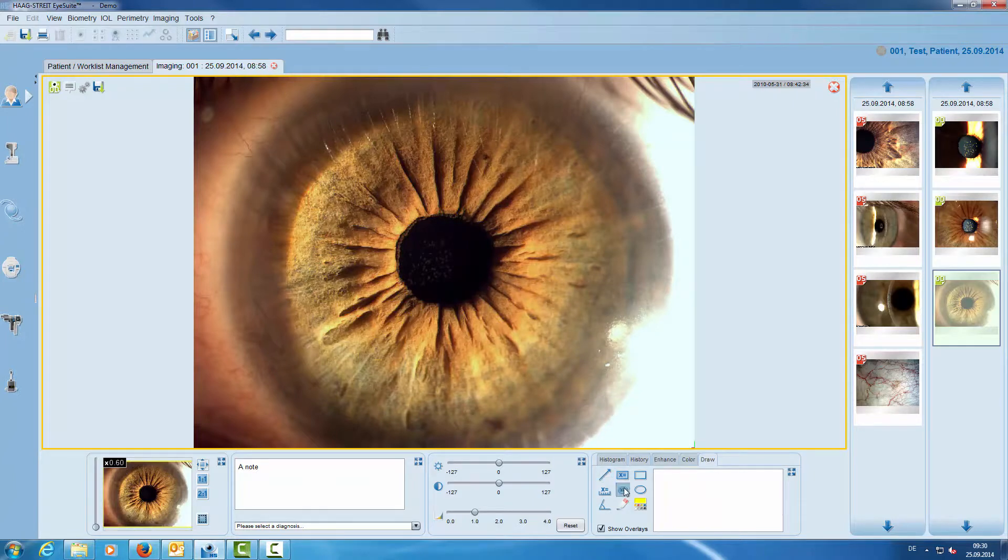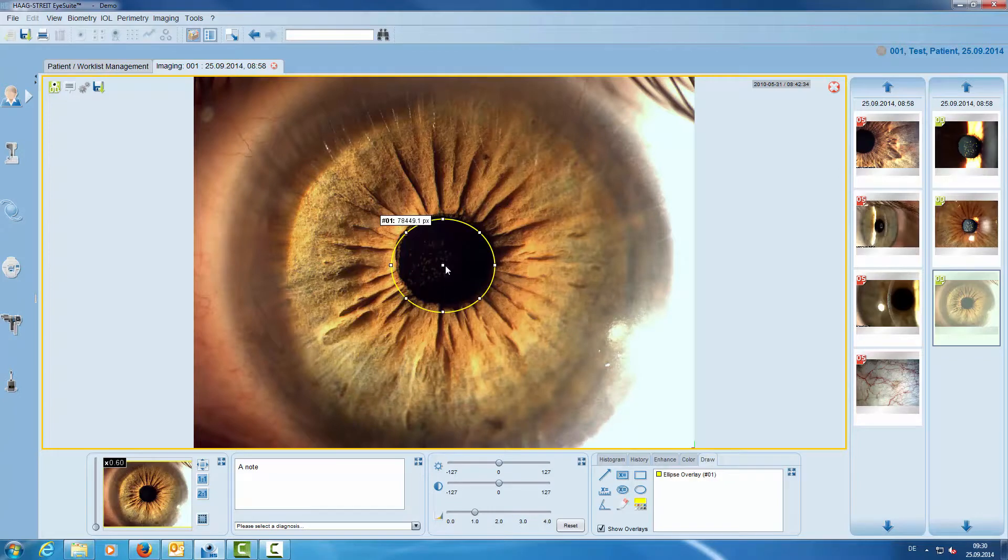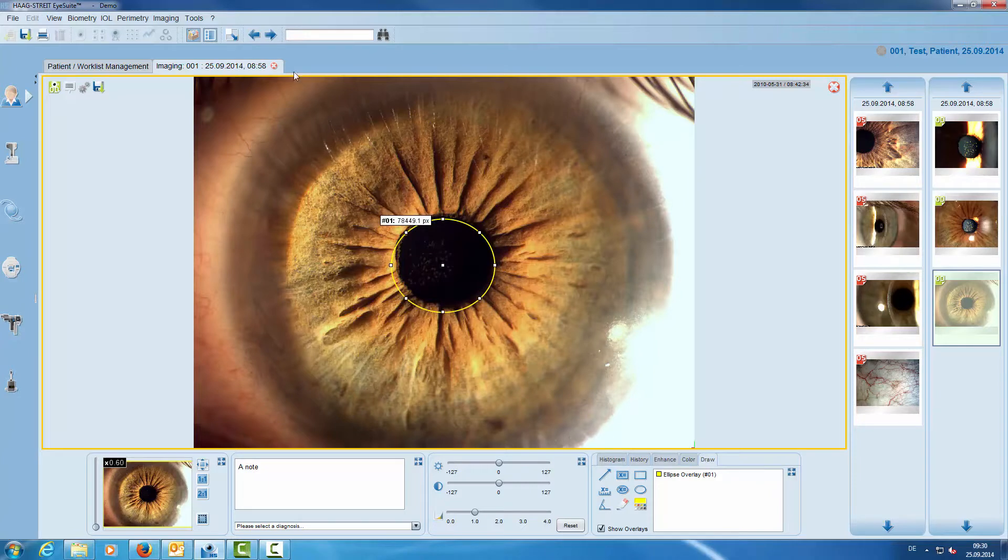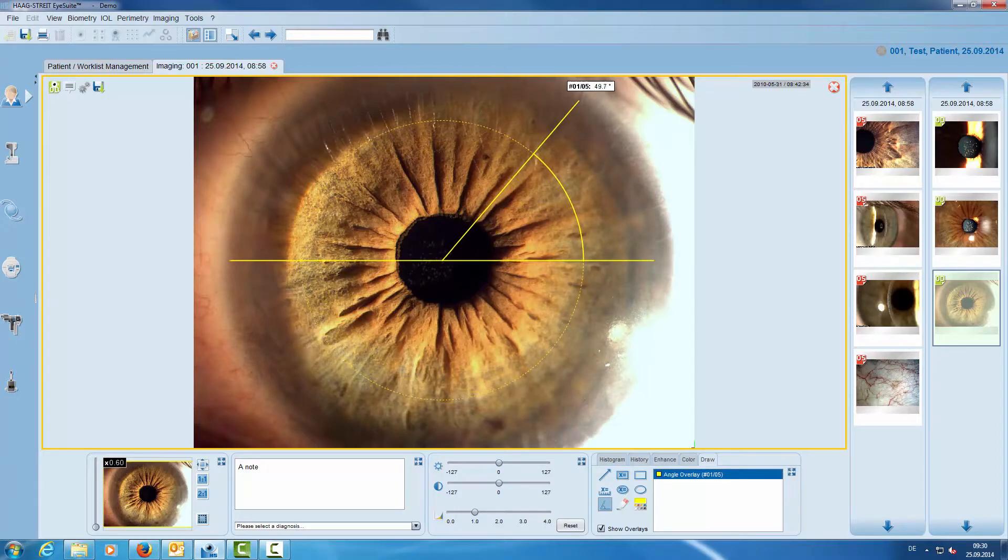We also can measure a surface. Here we have the angle tool which allows us to measure any angle on the image.